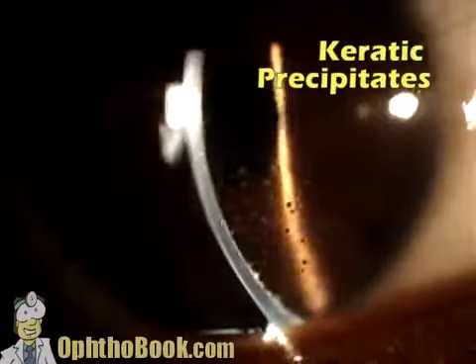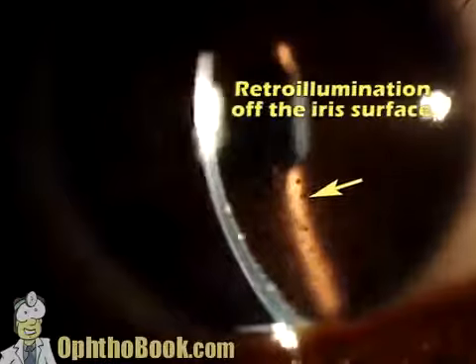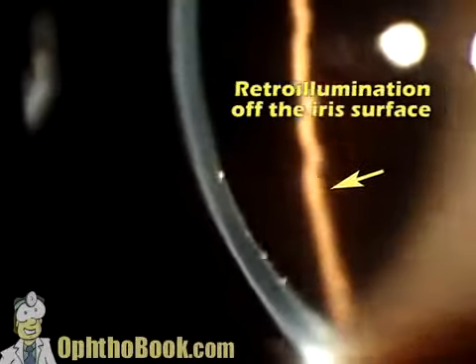This is KP splattered on the back of the cornea, and we know it's on the back of the cornea because we can use our slit beam once again. You can see how it lights up on the back surface, and you can even use retroillumination off the iris to see those dark spots by looking at the bright iris as a background.